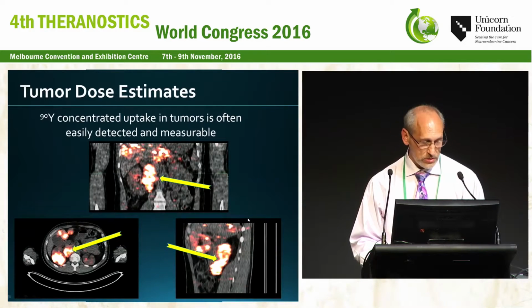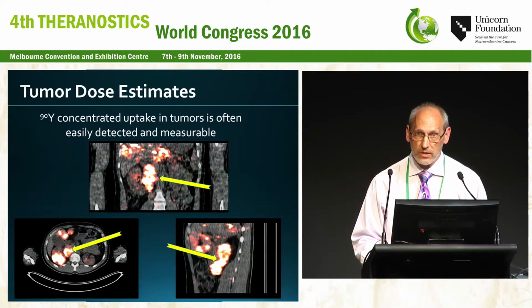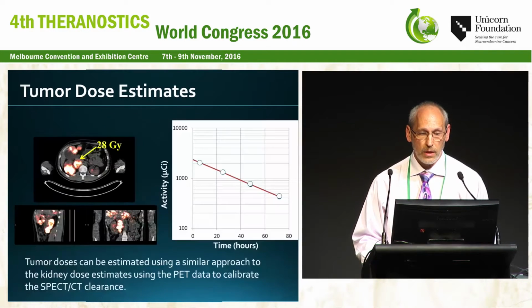What we're doing for the kidneys, we can also do for tumors, as long as it's within the field of view. We do the same thing as long as we can delineate the volume. We can measure the time course, we can integrate under the curve, and we can get counts, and we can measure the dose to the tumor from this as well.